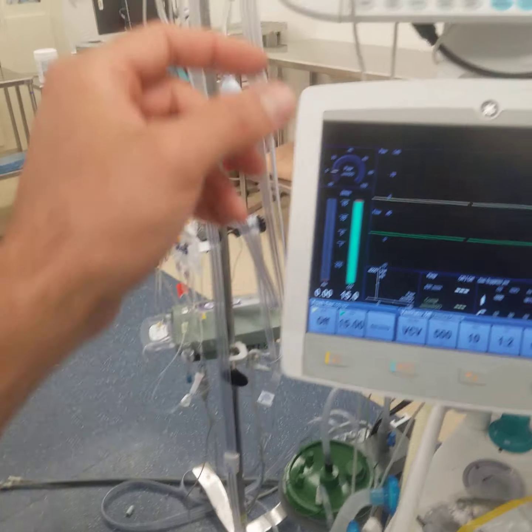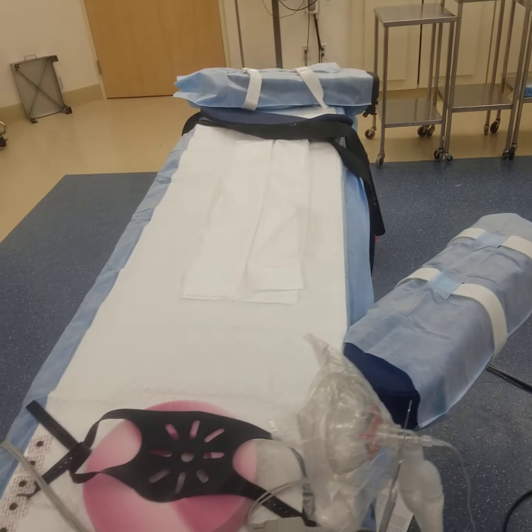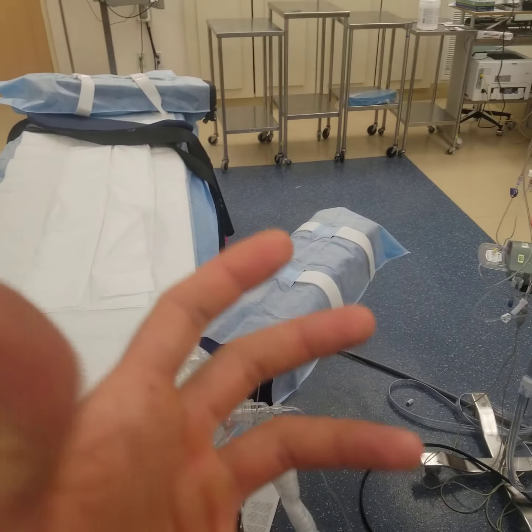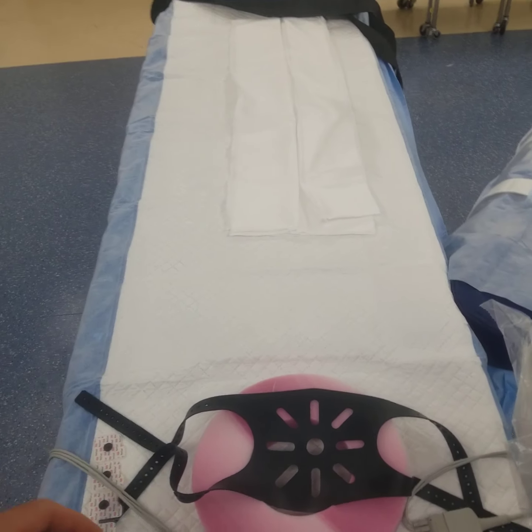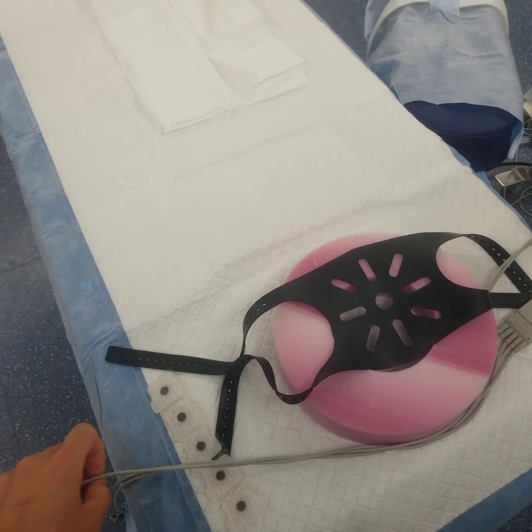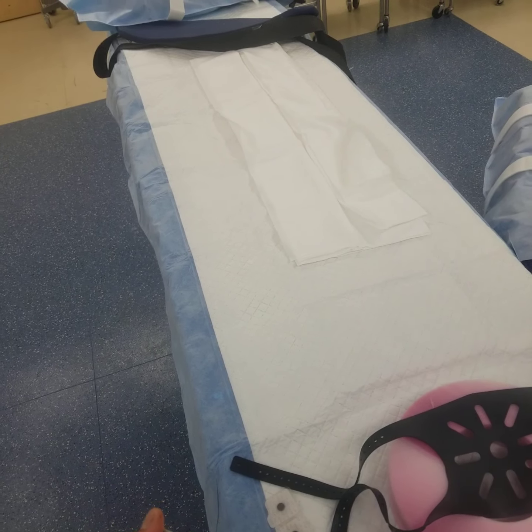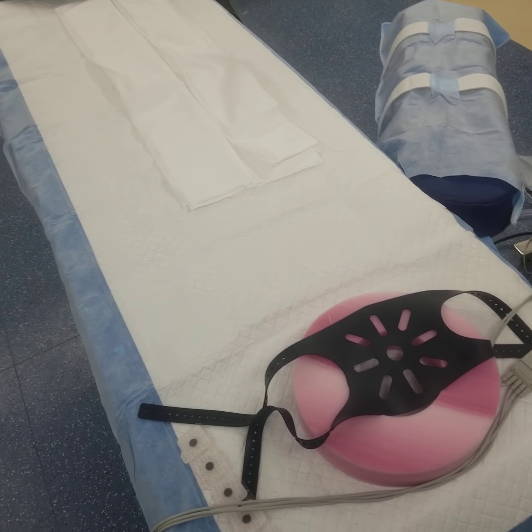So O2 sat goes on, probably the finger with the IV. Blood pressure cuff goes on the opposite so that it doesn't interfere with your IV and it doesn't interfere with your O2 sat. Put your leads on, right? So my leads are already laid out with my stickers. So your brown lead's going to go V4 or V5, and then the rest will go as you normally would.